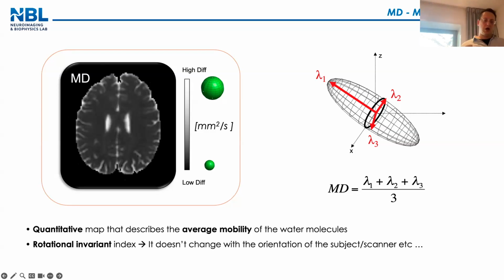First of all, we collect as raw data from the scanner DWI, diffusion weighted images. And we have a b0, the T2, essentially. By the way, it's called b0 because it's also a DWI, weighted in diffusion with weighting equal to 0. So essentially there is no diffusion there. That's why I say T2 or b0 is exactly the same thing.